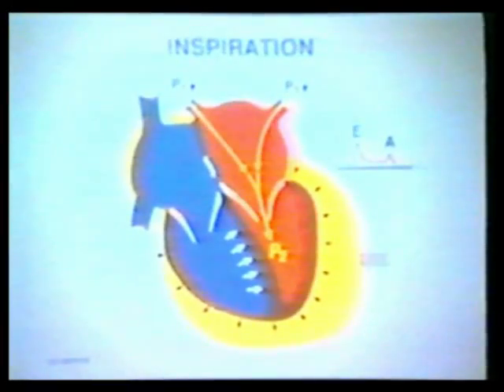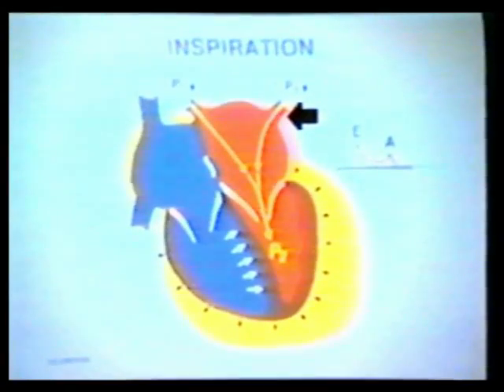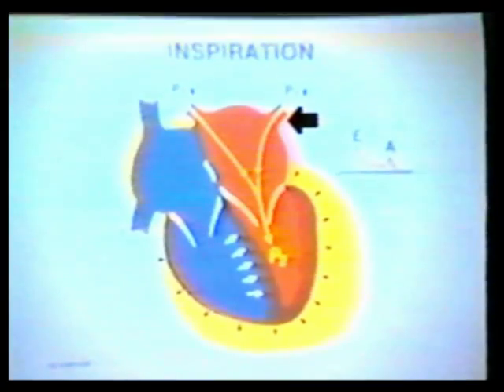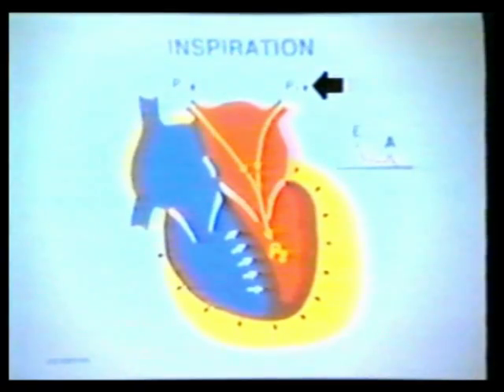For the patient with a tense pericardial effusion, the situation is different. The pulmonary veins are outside the pericardial sac. Therefore, the decrease in intrathoracic pressure with inspiration still results in a decrease in pulmonary venous pressure of equal magnitude to that seen in normal individuals.